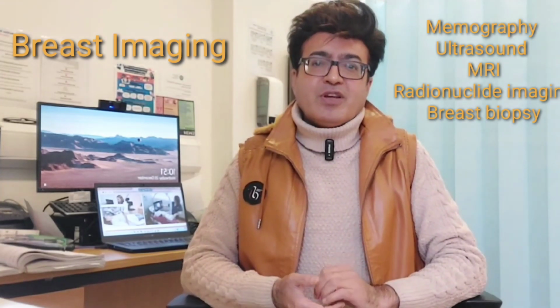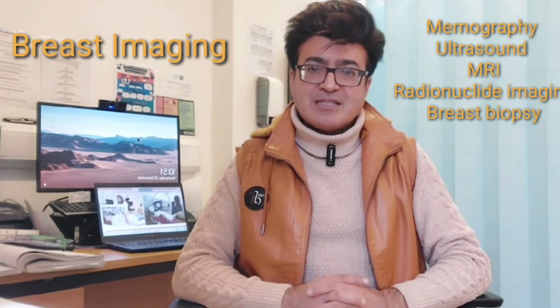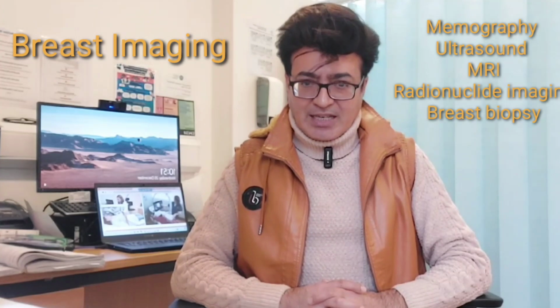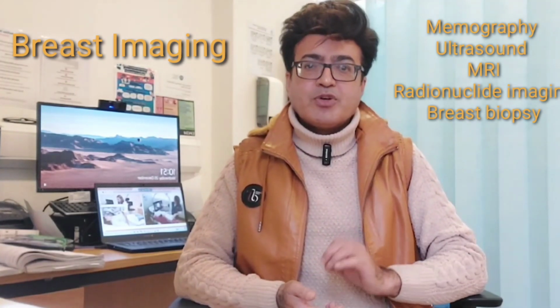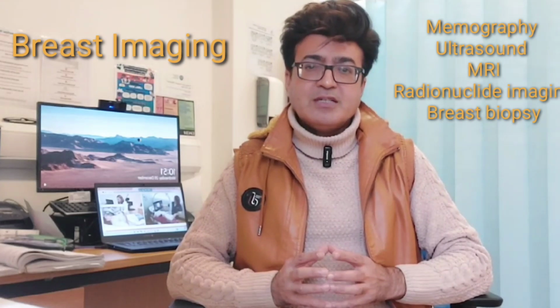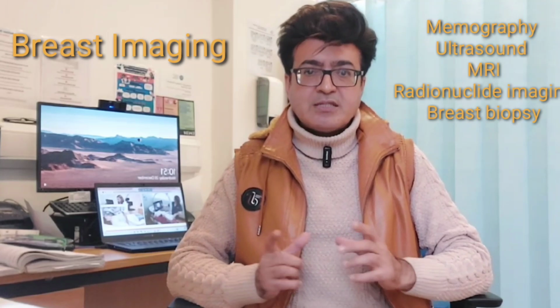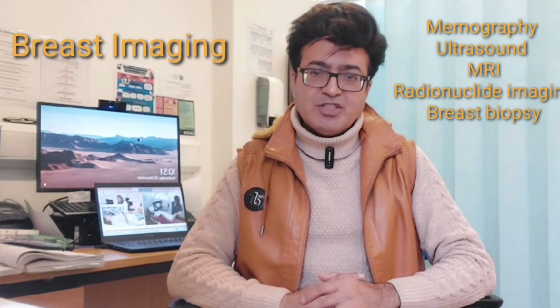Today my topic of discussion is breast related. As you know, I'm discussing breast imaging, breast imaging techniques and breast pathologies. Related to that, the first and important thing was that I should discuss how many types of imaging technique do we have for the imaging and diagnosis of breast lesions. So this video would be related to breast imaging techniques.